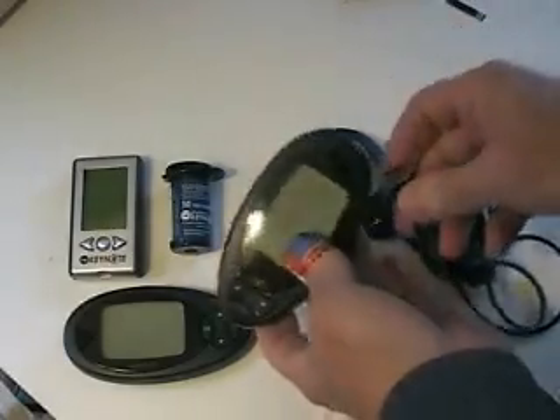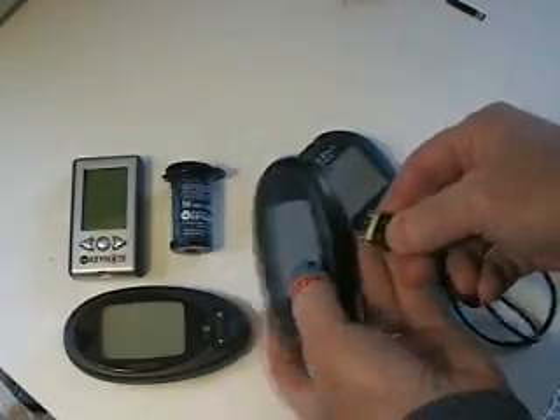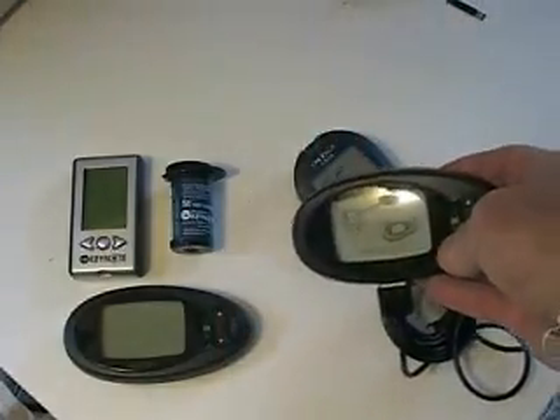Now I'm going to calibrate it against the Dexcom by plugging in the cable. The cable is one of the biggest design flaws, I think — it's way too long. And now let's count.